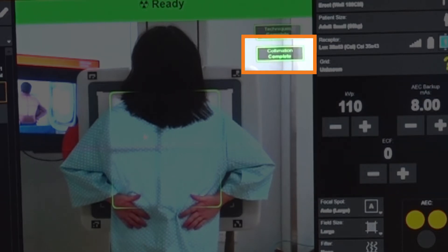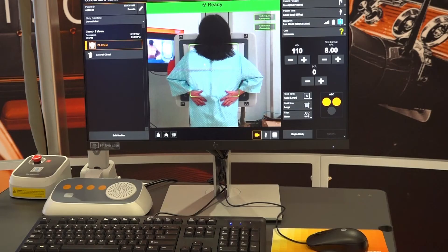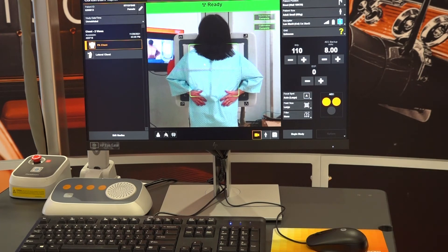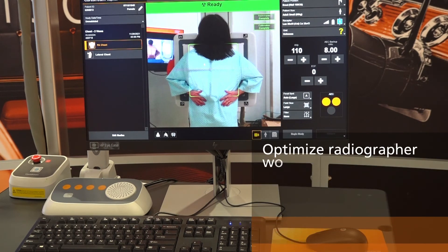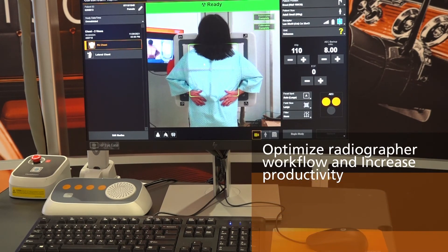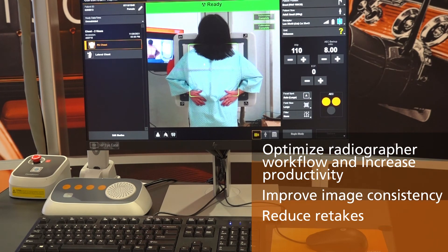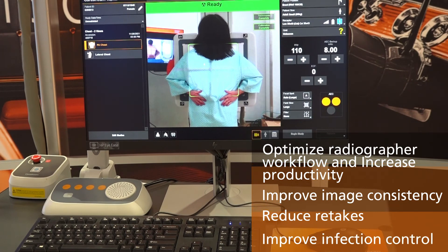Additionally, SmartCollimation uses camera input to adjust the collimation field to automatically apply the field to the anatomy being imaged. At all times, the radiographer is in full control and can certainly override any of the exposure or collimation settings based upon their liking. To summarize, the benefits include helping to optimize the radiographer workflow and increase productivity, helping to improve image consistency, helping to reduce retakes, and also helping to improve infection control by limiting direct patient contact when needed.